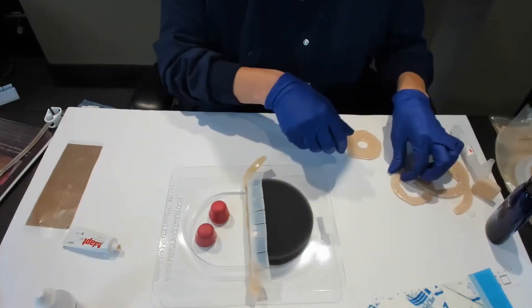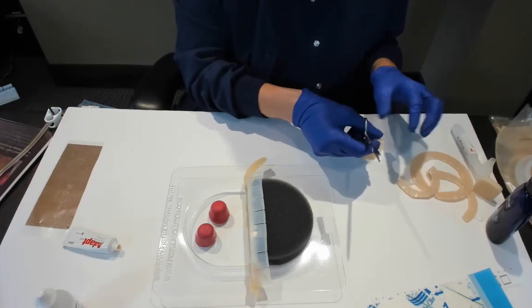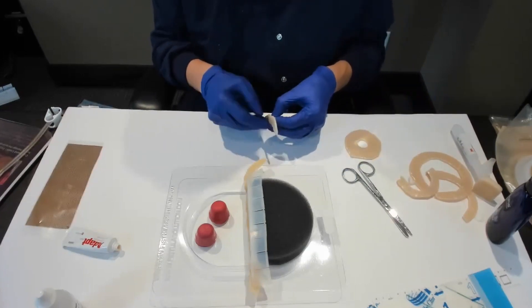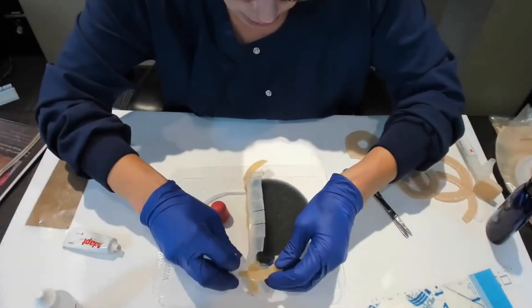You're going to want to have your hydrocolloid come all the way out onto the skin. Sometimes I'll even add a section on the edge of the wound just to help with this landing. I got extra over here, but like this guy over here, I might want to add a piece of this to the skin edge.